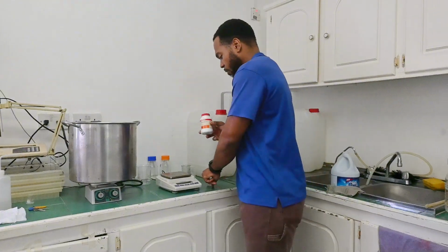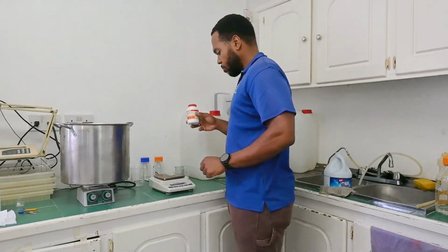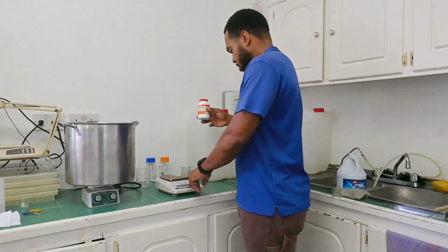So first we have to zero out the scale after putting the weighing tray on it.